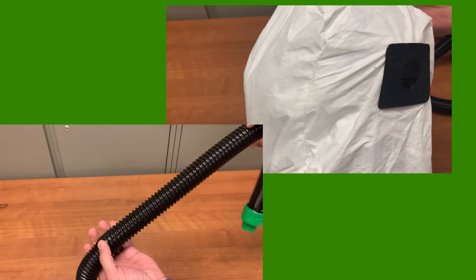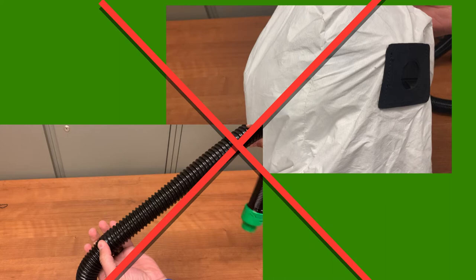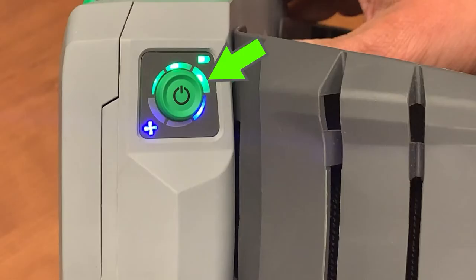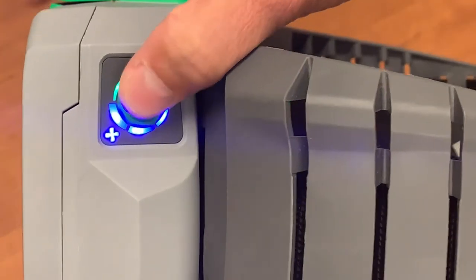Troubleshooting: If at any point while inspecting the device you find tears, breaks, or cracks in the hose or hood, do not use that item. Obtain new supplies before entering airborne isolation. If the airflow is insufficient when using the airflow indicator, check the battery charge. If it is fully charged, increase the airflow settings to level 2 or 3.